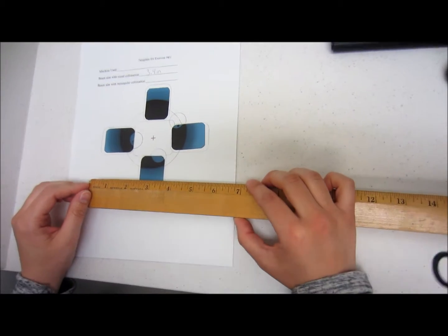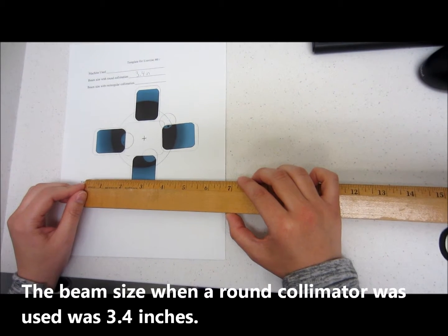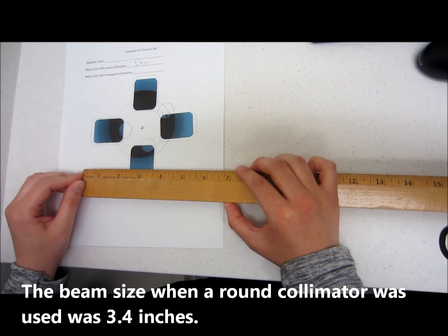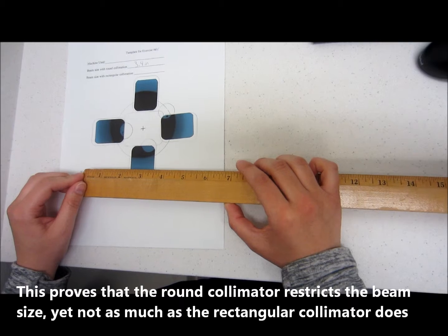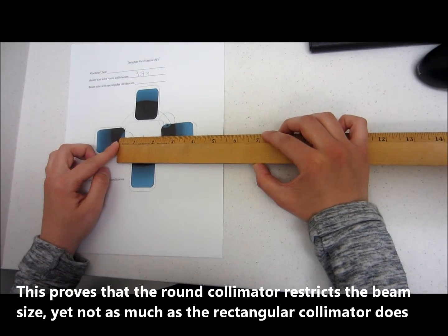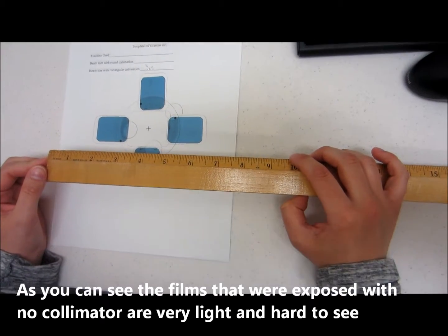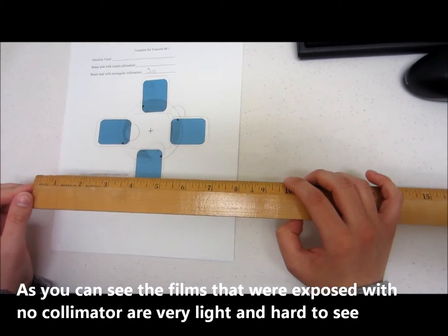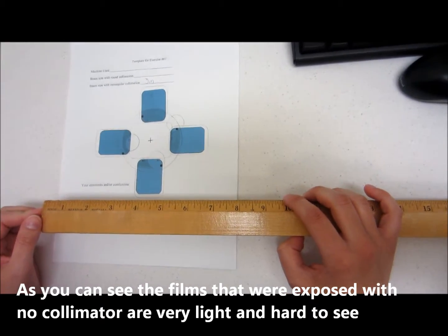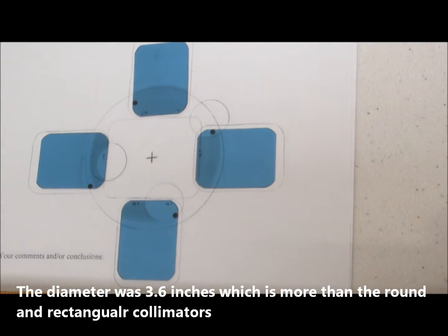The diameter of the beam size when a round collimator was used was 3.4 inches. This proves that the round collimator restricts the beam size, yet not as much as the rectangular collimator does. As you can see, the films that were exposed with no collimator are very light and hard to see. The diameter was 3.6 inches, which is more than the results for both the round and the rectangular collimators.